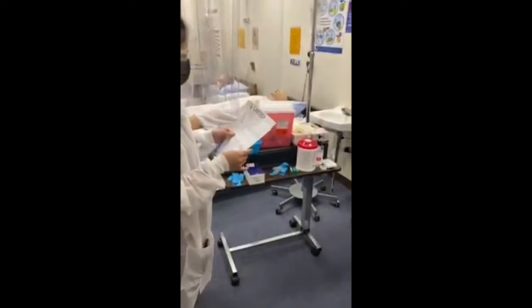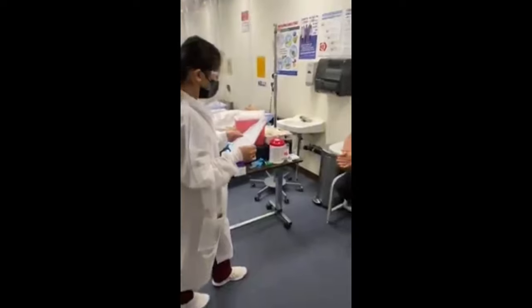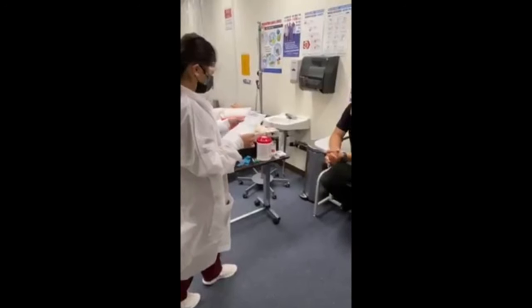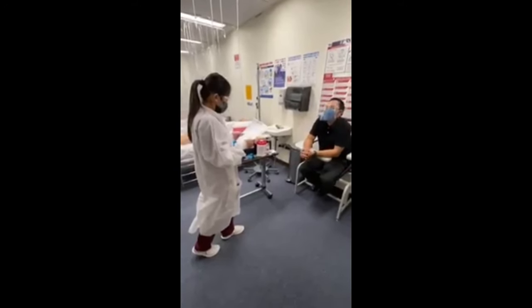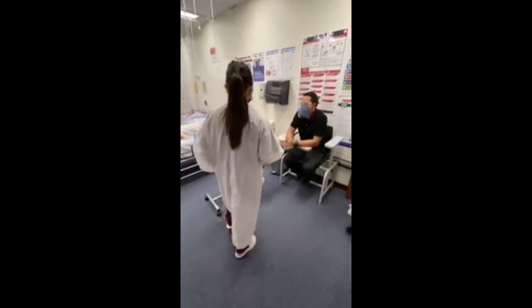Miss Janine, I'm just going to draw some blood on you today. Okay. I just need to verify your first and last name and your date of birth. Okay, sure. First name, Romel, last name, last school, date of birth, 10-6-98. Okay, all right. So, let's get started.